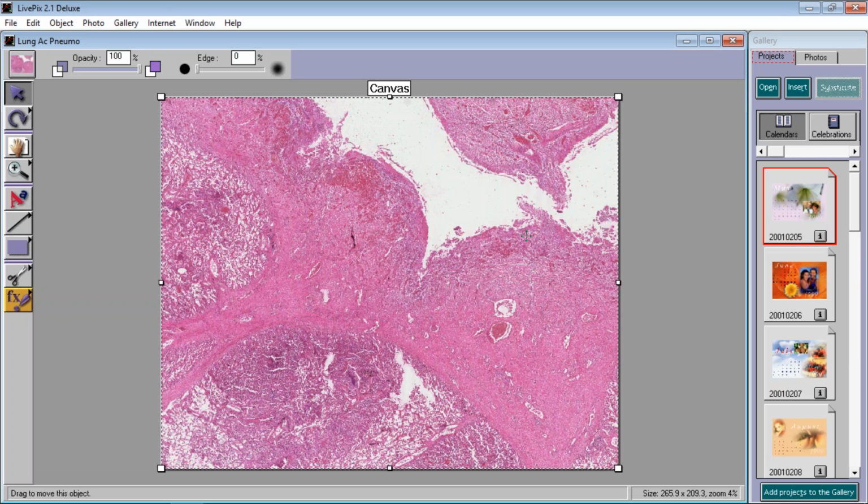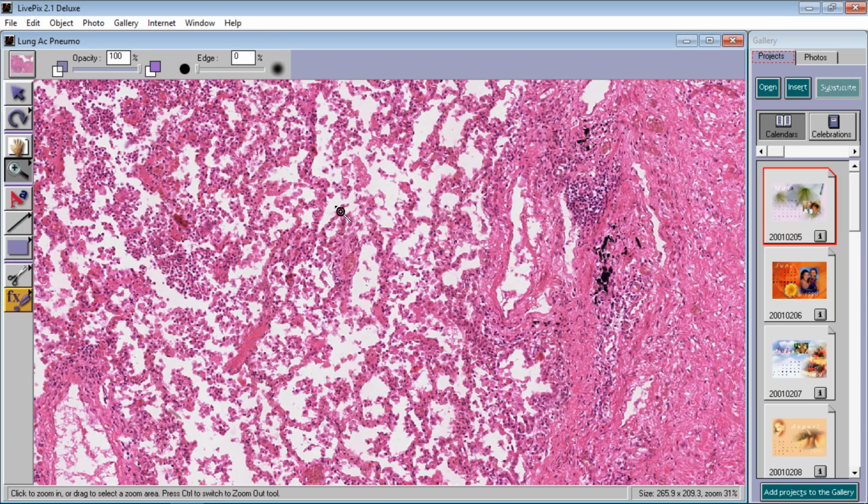And you say, well, is this a lung? I don't know. I don't see too many air holes. But you do see over here in the northwest that there are still some alveoli, don't you? See? But look, the alveoli look like they're starting to fill up with cells. What kind of cells do you think are filling up these alveoli?